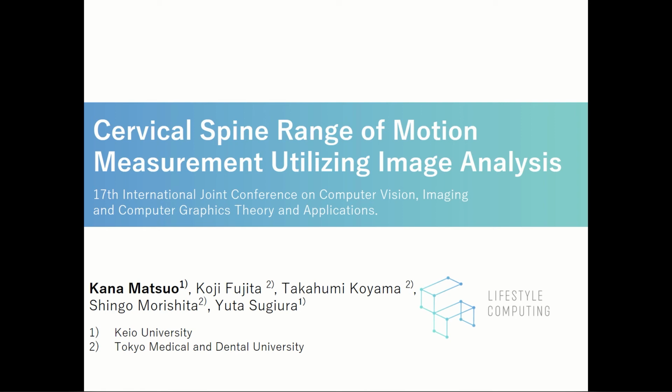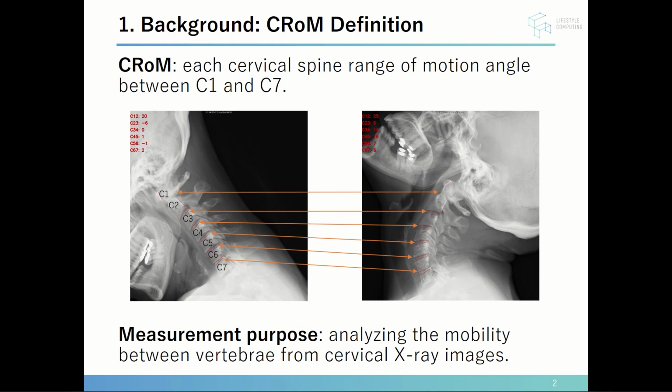We introduce cervical spine range of motion measurement utilizing image analysis, a system that measures cervical spine range of motion angles. First, I introduce the definition.